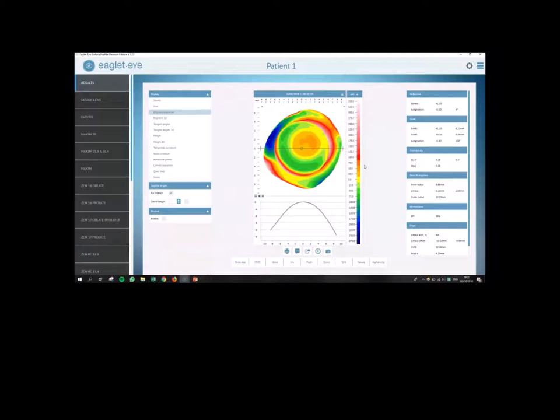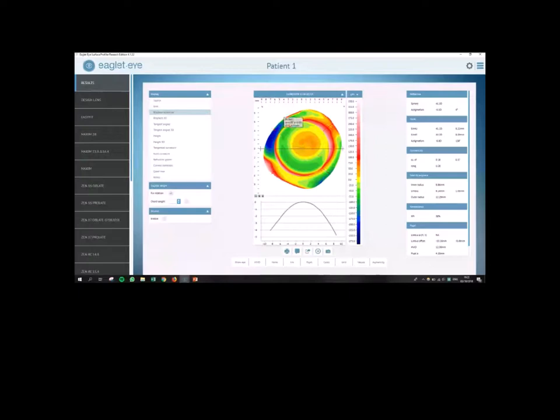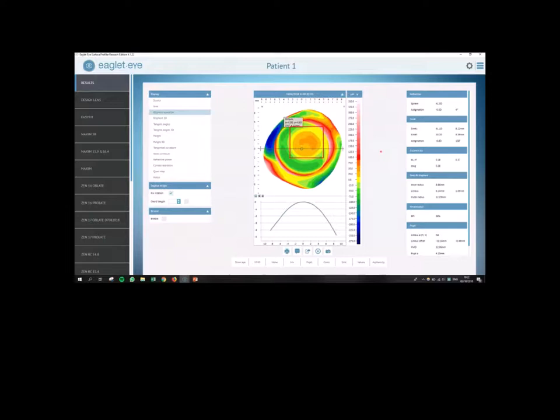So if you look at this eye right now, it's looking quite normal. You might suspect a little bit of scleral toricity because over here, it looks a little bit more blue. Over there it looks a little bit more red for the people that are really paying attention. If you look at this center area up here, you notice that it's quite a large flattening. So we're not seeing that center red. This is because this patient is wearing ortho-K lenses. So that's how you can kind of recognize an ortho-K wearer based on sagittal height data.